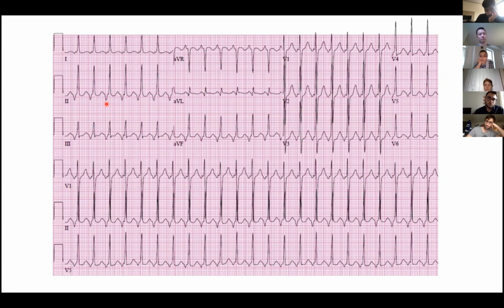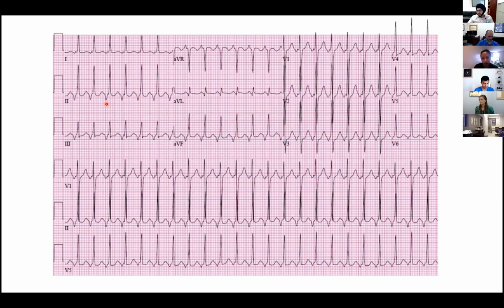Longer. Okay. So now if we go to our little diagram and we have our long RP tachycardia, what is your differential diagnosis? If I'm just looking at the algorithm, there are 5 differentials, but I think we can rule out sinus tachycardia just because there's retrograde P waves. The same would go for sinus node re-entry; the P wave doesn't make sense. So we would have focal atrial tachycardia, possibly AVRT, and atypical AVNRT.